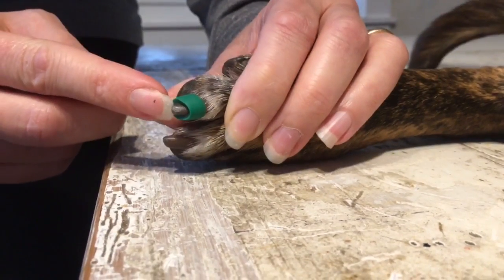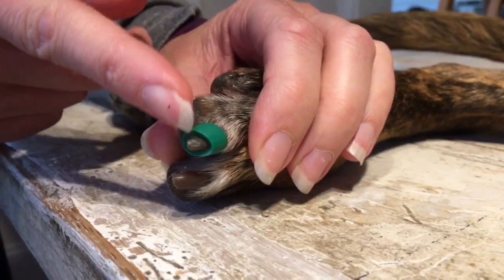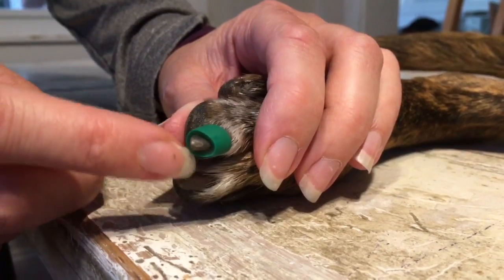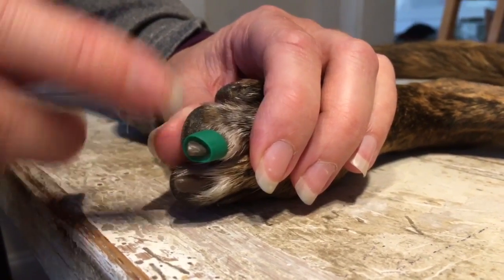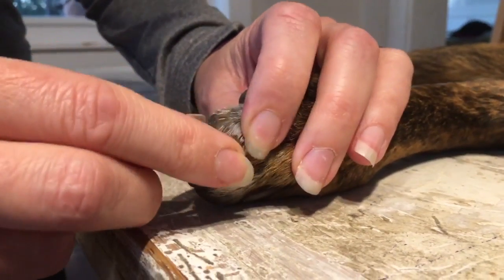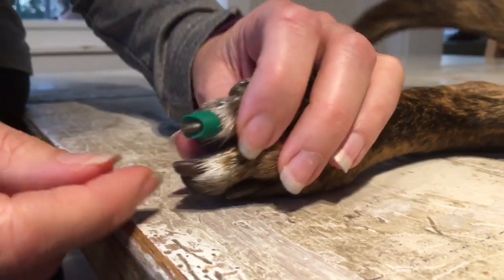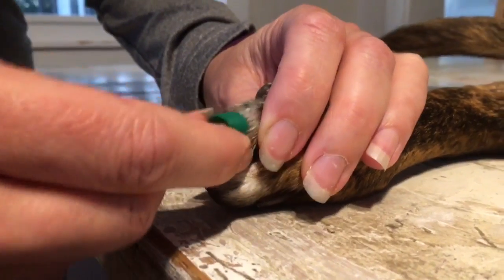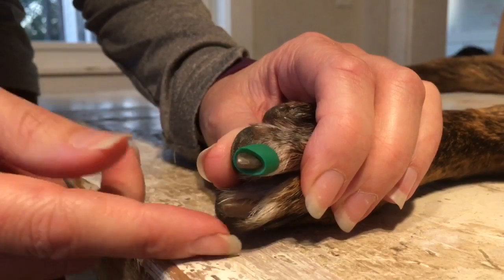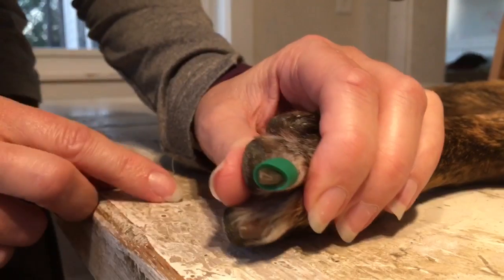I don't really work it very far on the bottom, because it needs to be in the grip zone. If you push it too far on the bottom of the nail, it moves up the nail shaft and just becomes a decoration or a nail ring. So it's critical that on the bottom, we know that it's contacting the ground when the dog is in stride. But on the top, I do angle it further back, being sure that I'm not anywhere near the skin of the nail bed. And side to side, just slowly working it in place. Once you get the hang of this, it's pretty intuitive and you can do it very, very quickly. That's what I mean by working the toe grip up the nail into place.